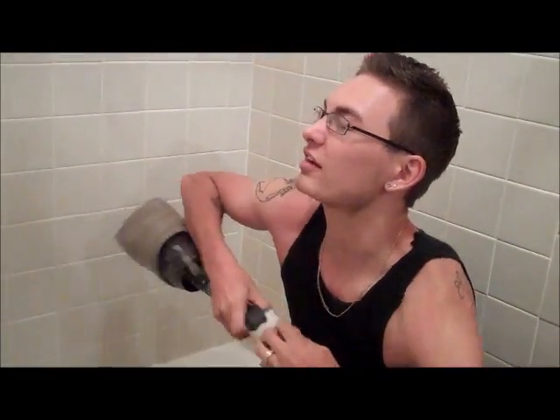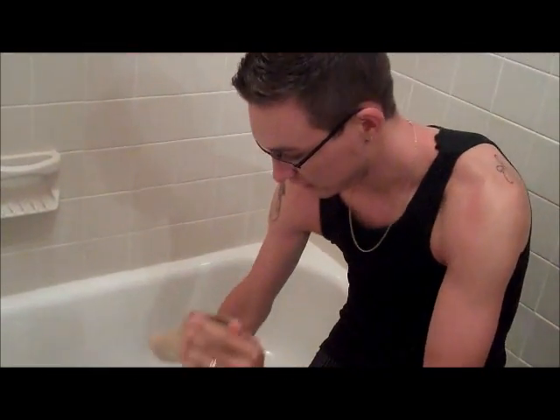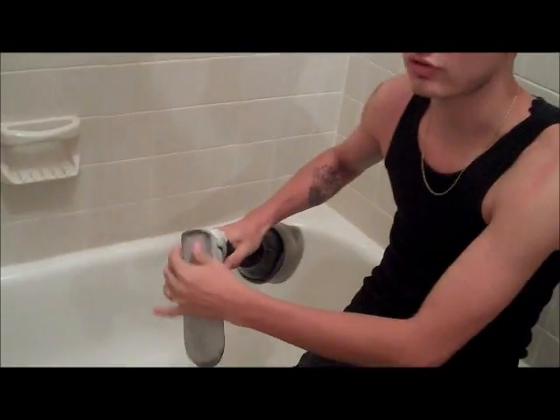First you just got to remove the foot shell, and there's water coming out already. Just remove the shell, and you're going to have some water in there you didn't really know was in there. Some sand and crap is coming out too.